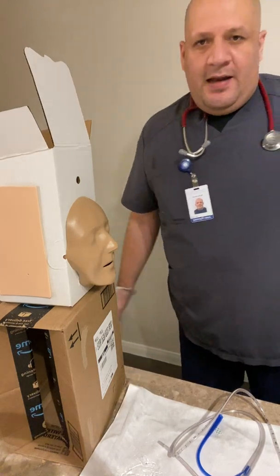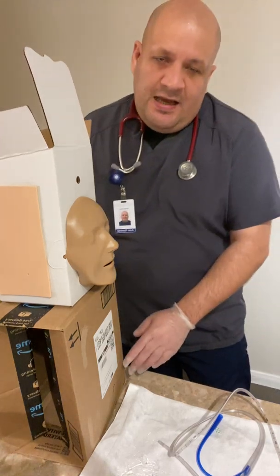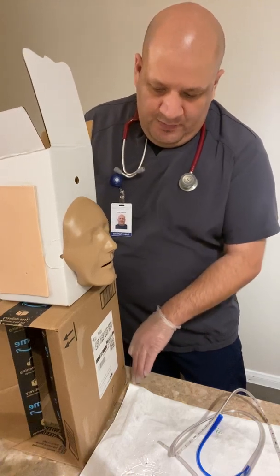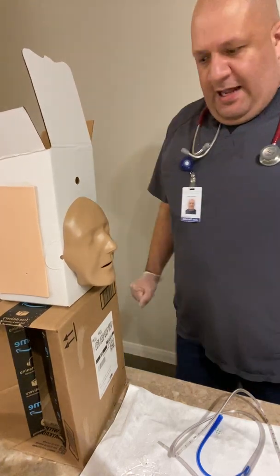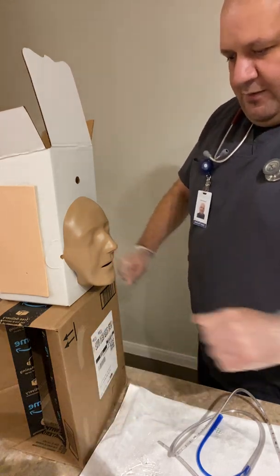Okay. I'm going to go ahead and provide some privacy. I'm going to sit the patient at a high Fowler's position. So I'm going to go ahead and sit him up. Okay. I am going to put a towel on his chest. Okay, the towel is there.